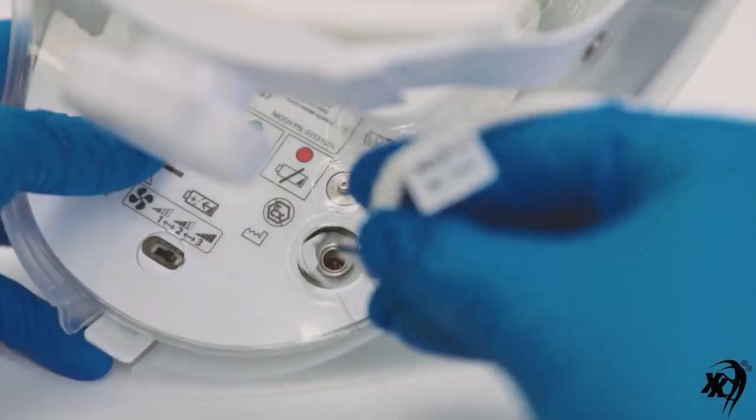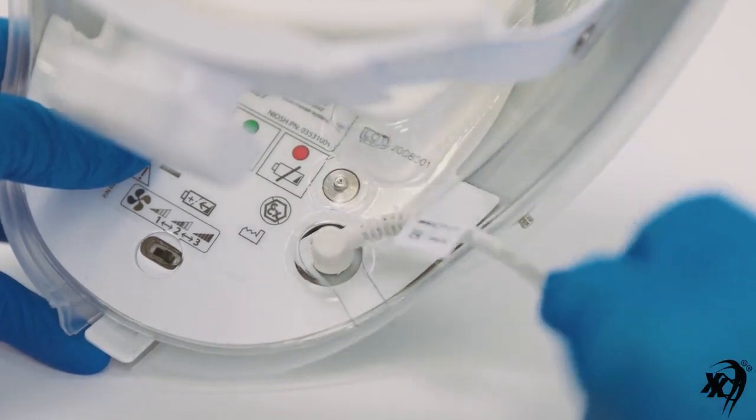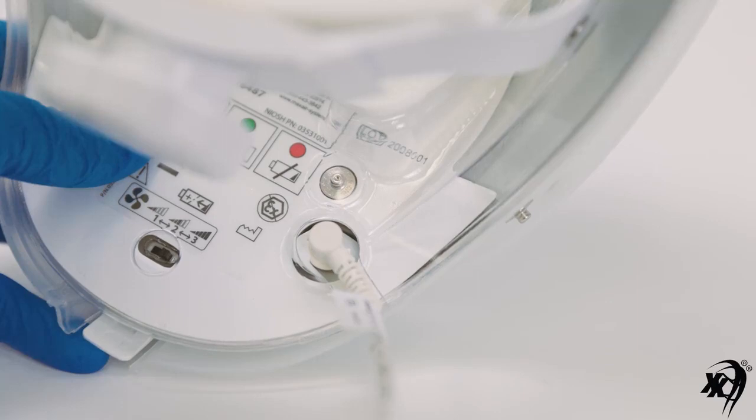When aligned, simply push the cord connector fully into the helmet connector. Then turn the cord connector approximately 180 degrees so the cord is exiting out from under and backward of the helmet.